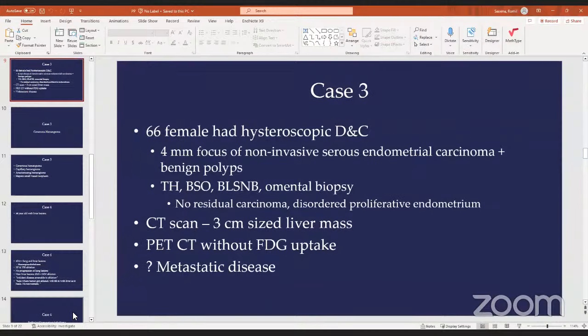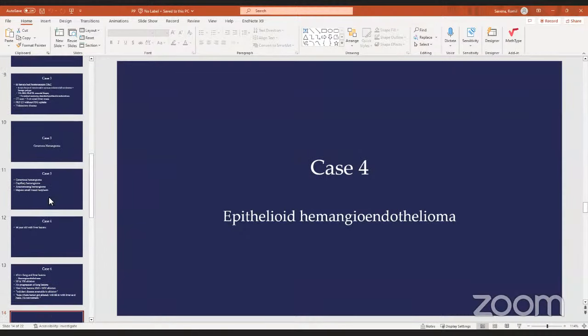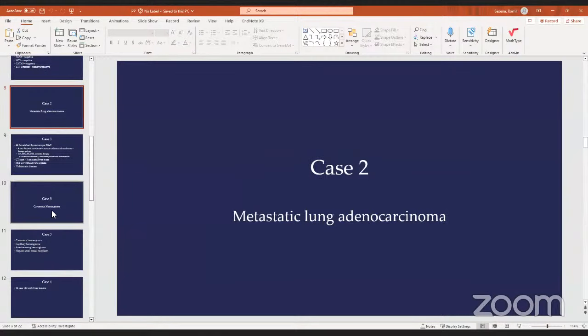And this is our diagnosis of a cavernous hemangioma. So cavernous hemangioma is the commonest benign lesion in the liver. And the data comes mostly from older autopsy studies where they were looking at tumors in the liver, and they found that a lot of people have cavernous hemangiomas. They go through life with this lesion, nothing really happens.